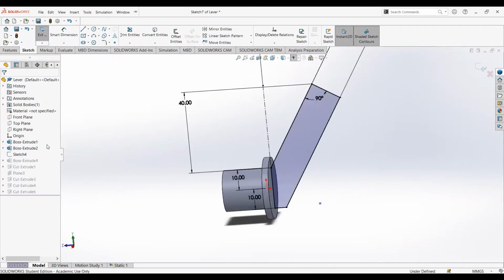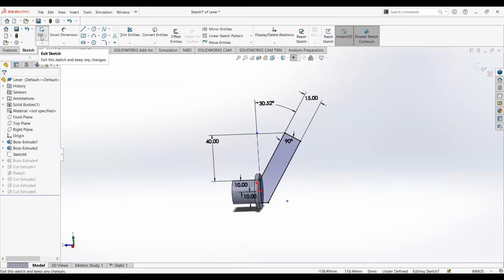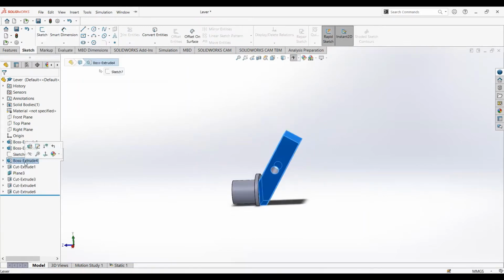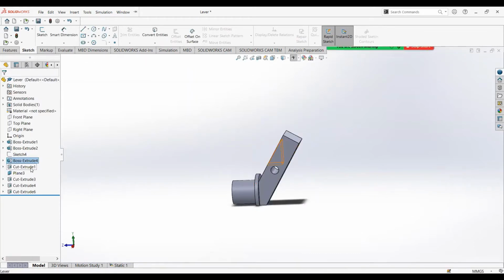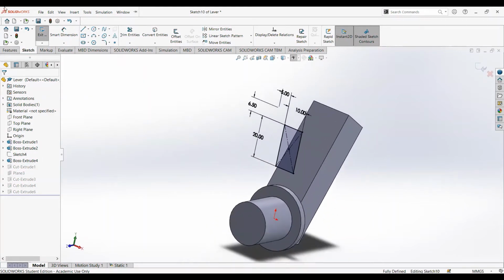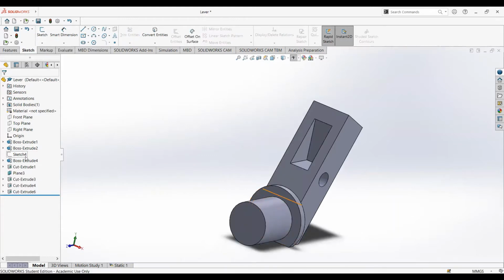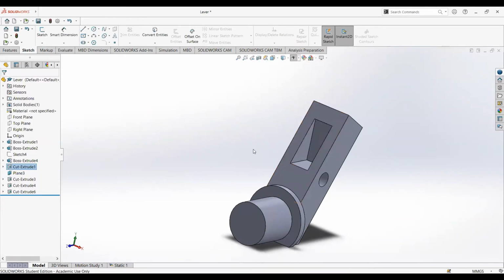We sketched this part, so the line was our guide. And then we created this with all the dimensions right here. After that, we extruded that part as well by 20 millimeter. After that, we used reference plane and we sketched this. And then we cut extruded that part. This is so we can put our T-shaped rod inside this and it can fit better.